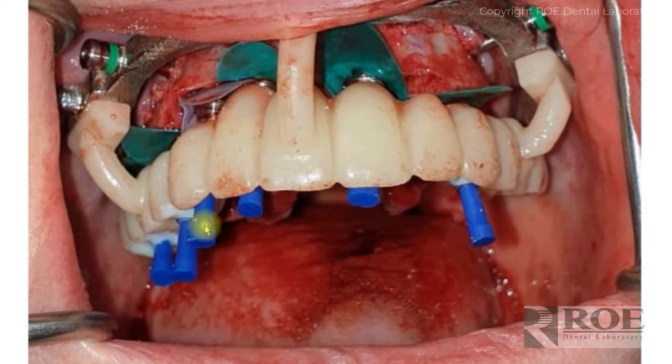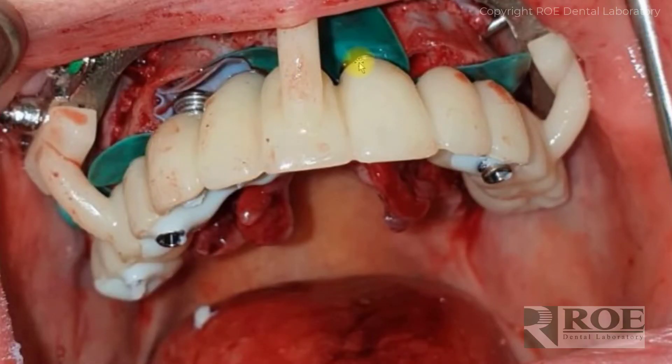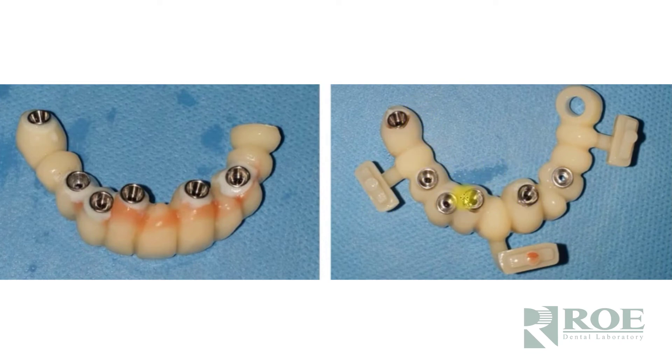Put in the temporary cylinders, put in the blue plugs, and backfill. The first prosthetic is what the patient wears during integration and healing. The second pickup here is the rapid appliance — you can see there's no pink — and this is the tool to transition to final in six months. One implant that appeared to have too much cantilever was removed at surgery.